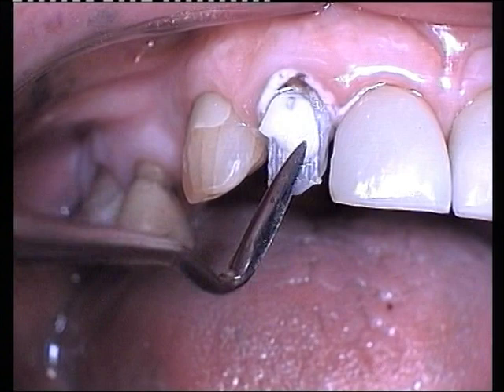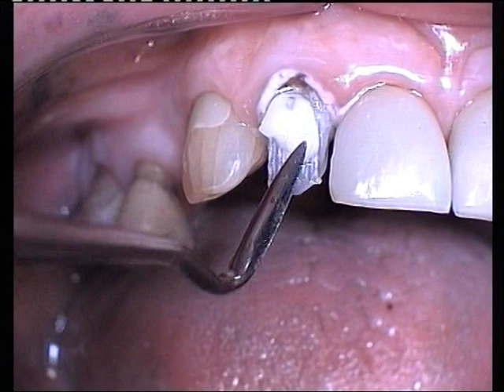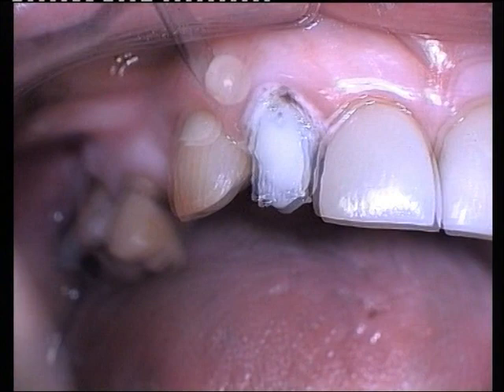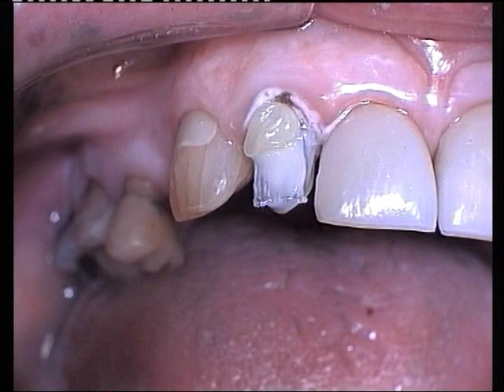A layer of opaque resin is placed over the fibres and spot-cured. A cervical increment of micro-fill resin is then puddled over the labial surface and spot-cured.